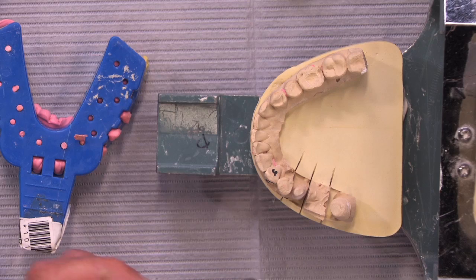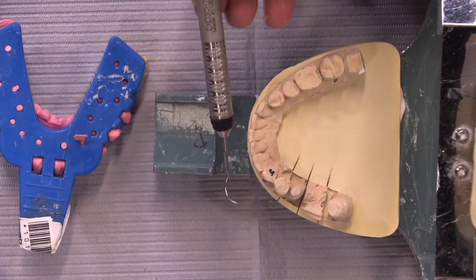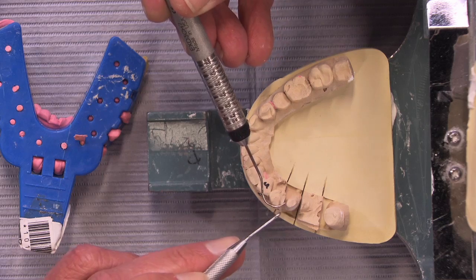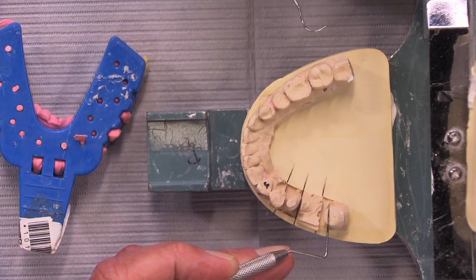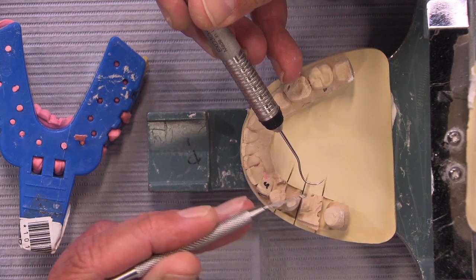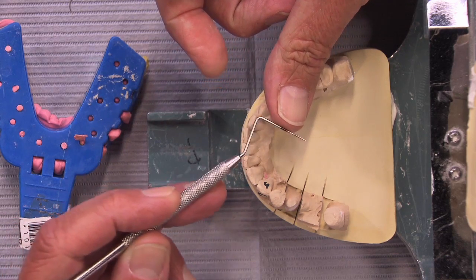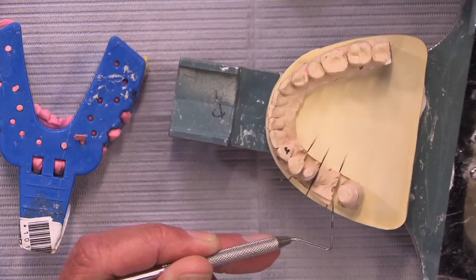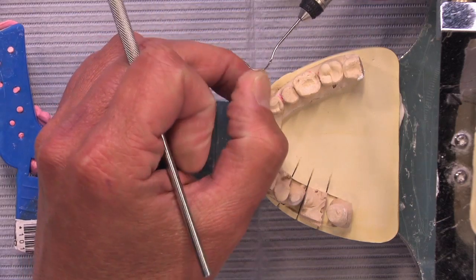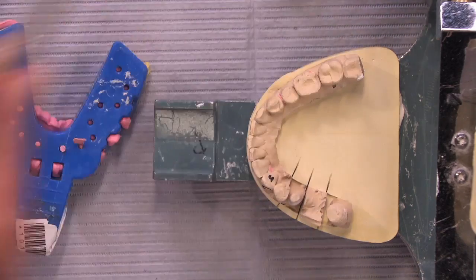I tend to do it with a football-shaped diamond, like a 379-023 diamond, named because it's shaped like a football. The thing I like about the football is that because it's convex, kind of like the surface of the explorer here, when I hold this down against the tooth and cut through the reduction coping by reducing the cusp tip, because of the shape of this, I actually get a little bonus reduction, if you will. Whereas you can imagine if I used a bur that was just a straight taper bur like this and held it to reduce this cusp tip down to the reduction coping, we would get enough reduction. But I like the fact that I get an extra tenth or two with a football bur because of the convexity that we see here. So again, you're just buying yourself a little more space when you do that.